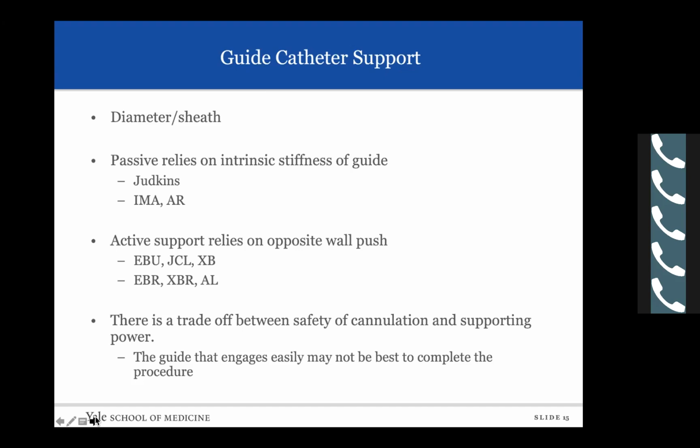And the great example of this, which I love to cite, is how many times the TIG falls out of the left coronary when you're trying to inject because the passive support is just frequently not strong enough.